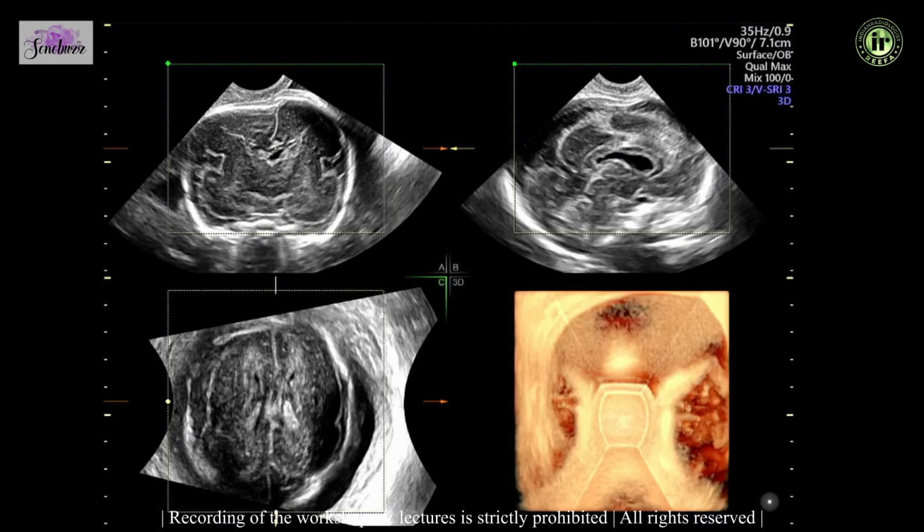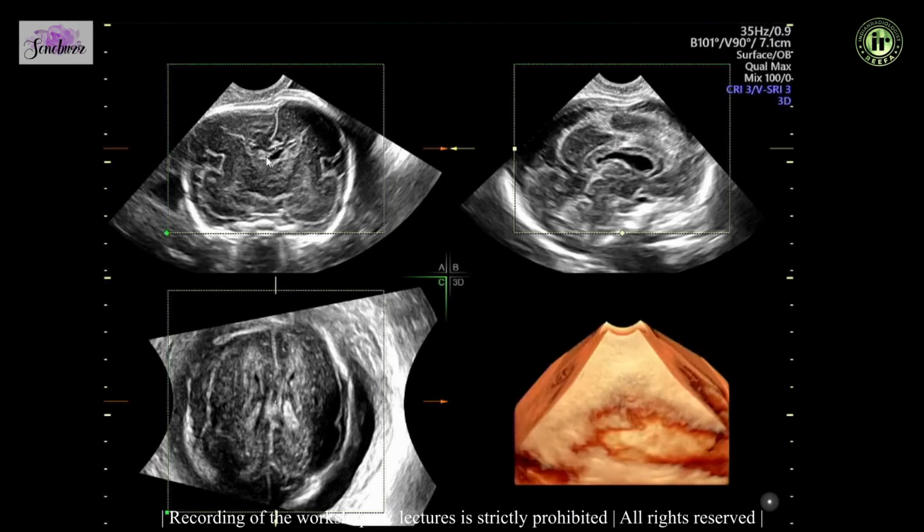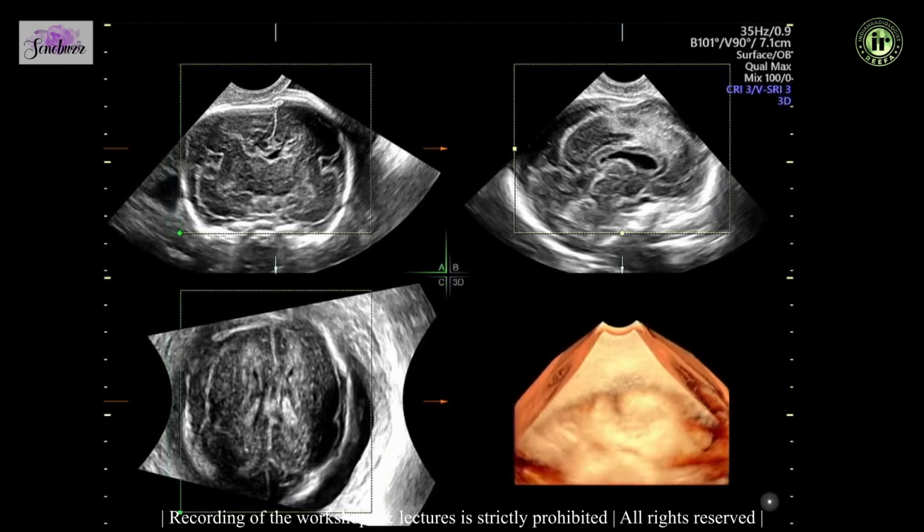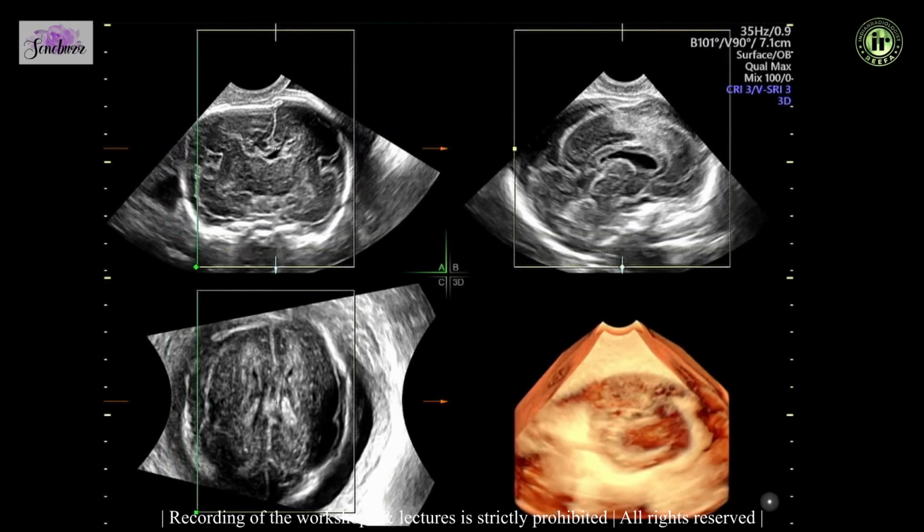Now you can see that the green bar is up here, which is cutting. The cutting area is from here where we would take a section. So we need to change that, and we go into the render and we'll take the left to right, and then we exit, and then we go into taking a thinner section here.